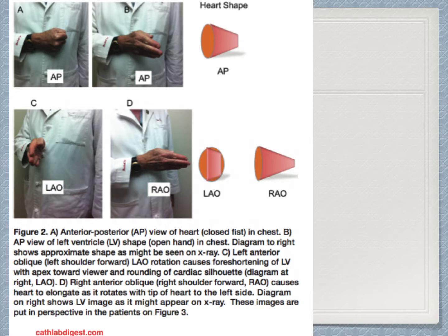It's like seeing the heart laterally. And on the right, you can see the heart shape with how it would look as a figure. This would help you understand the disposition of the heart and what you are seeing.